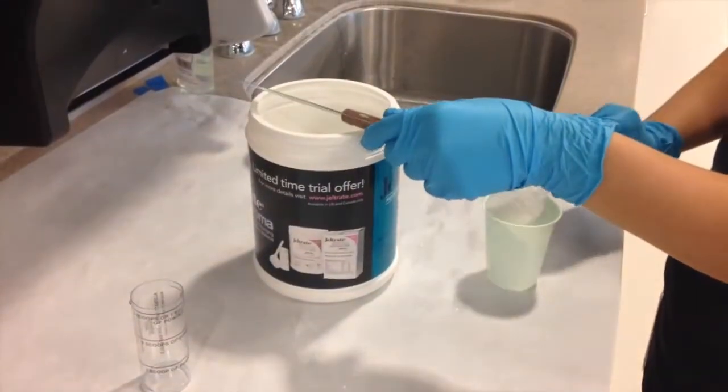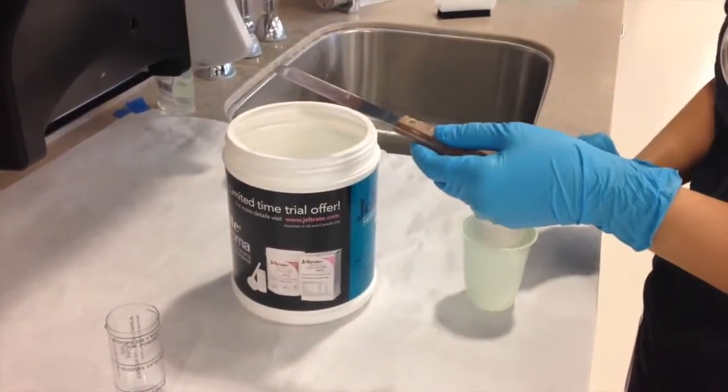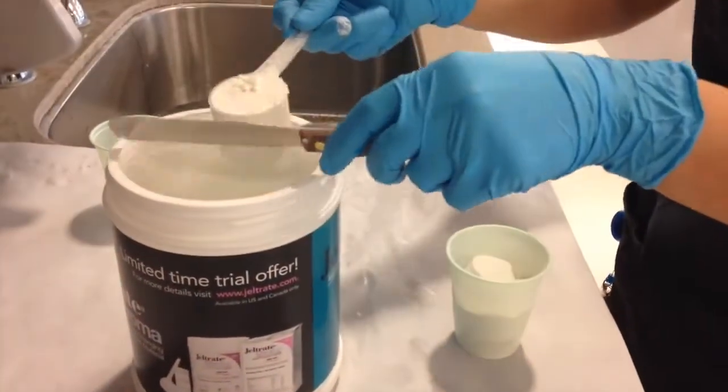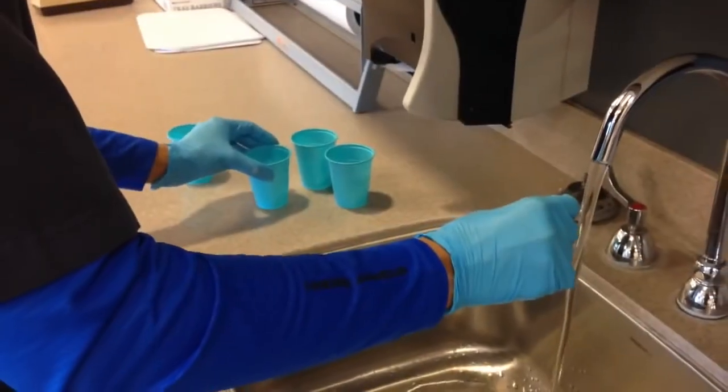First, you'll measure your alginate. Remember: one scoop of powder to one unit of water. Four scoops for the maxillary and three scoops for the mandibular. You'll use the small vial to measure the water.